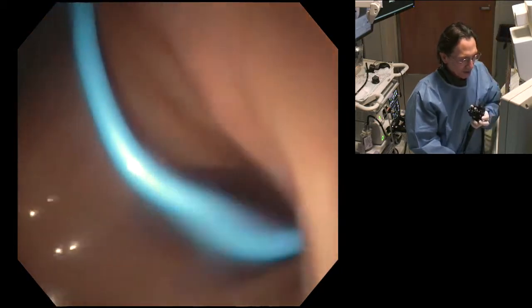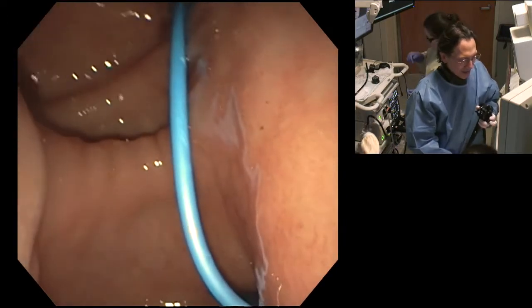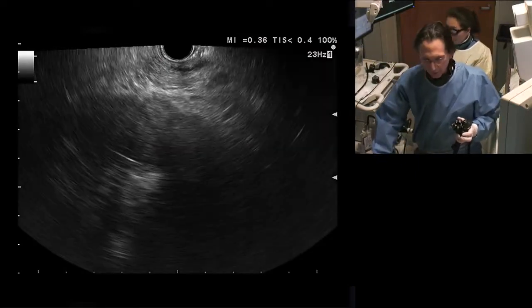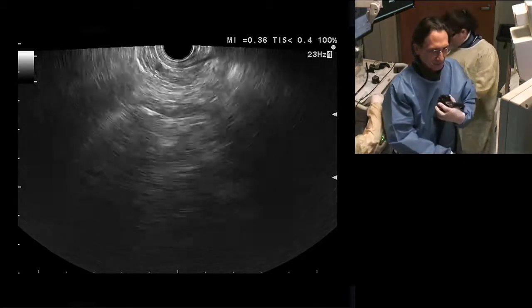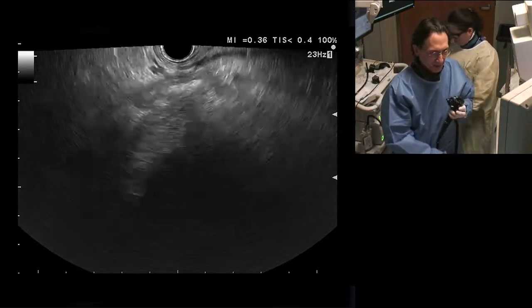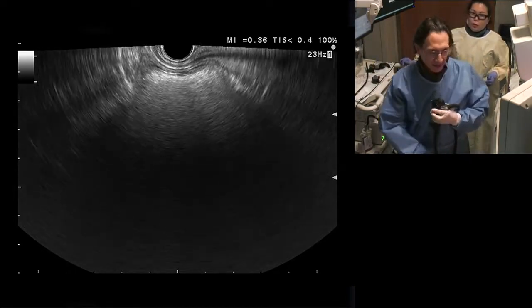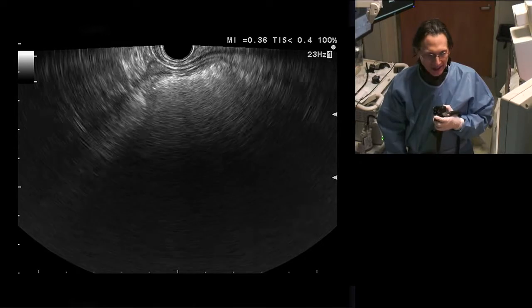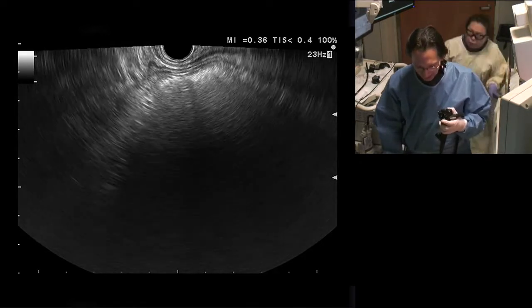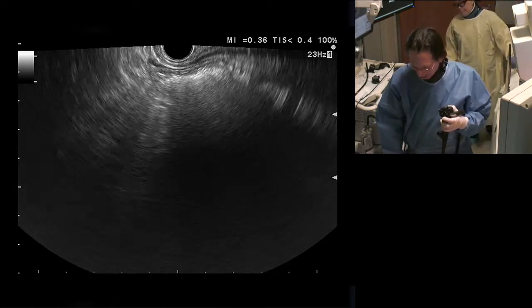All right, so here we are, and we're in the stomach. There's no need to go further down. We're just going to take out air, and we're going to switch to the EUS image. All right, now we're going to look for the loop of bowel, and we're going to help ourselves by putting some water. You can see a loop of bowel right now filled with a lot of air. And I wonder if that's the good position. This is where I have to say X-ray is not bad, being available to just sort of confirm position. So let's now first, okay, good.